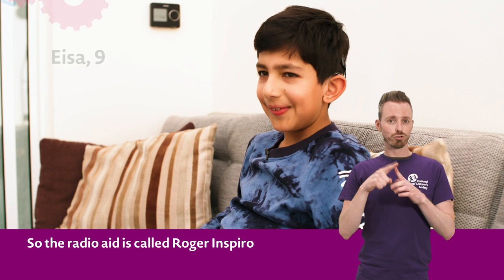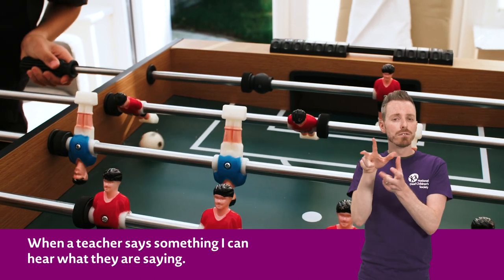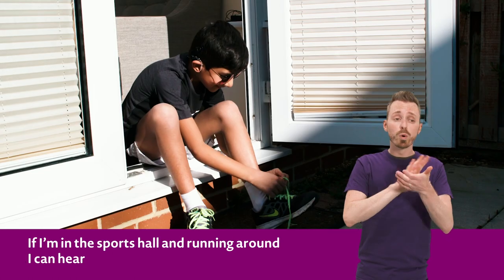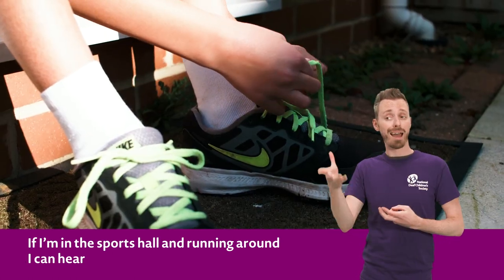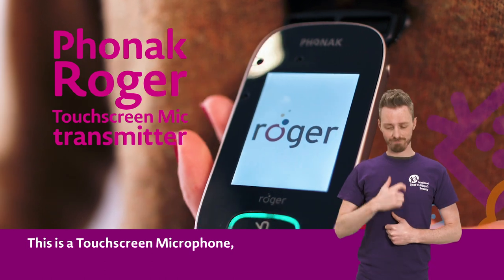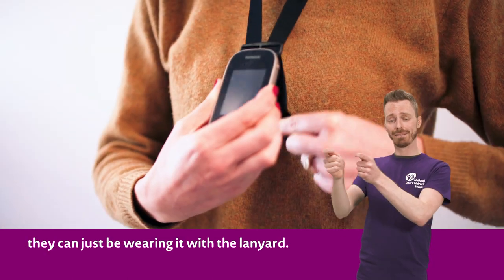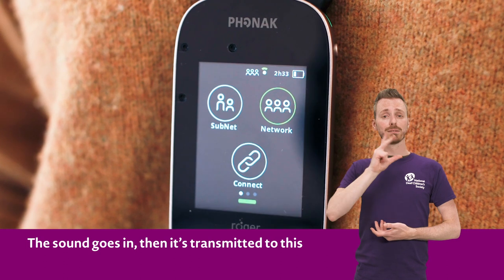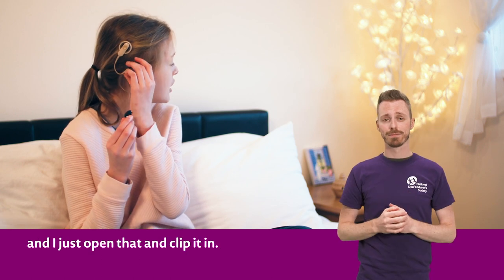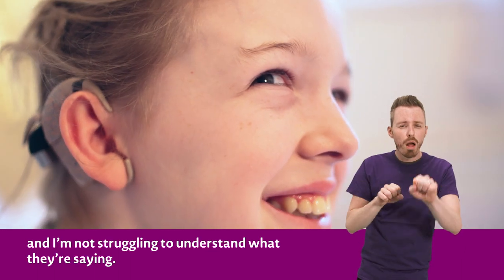The radio aid is called Roger Inspire and I have receivers in my cochlears. When the teacher's saying something I can hear what they're saying. Even if we're in the sports hall and running around, I can hear what the teacher's saying. This is a touchscreen microphone — for example, if I'm in the classroom it can just be worn with the lanyard. The sound goes in, then it's transmitted to this, which is plugged into my implant. There's a small flap at the back of my implant and I just open it and clip it in. It just means I can hear them easier and I'm not struggling to understand what they're saying.